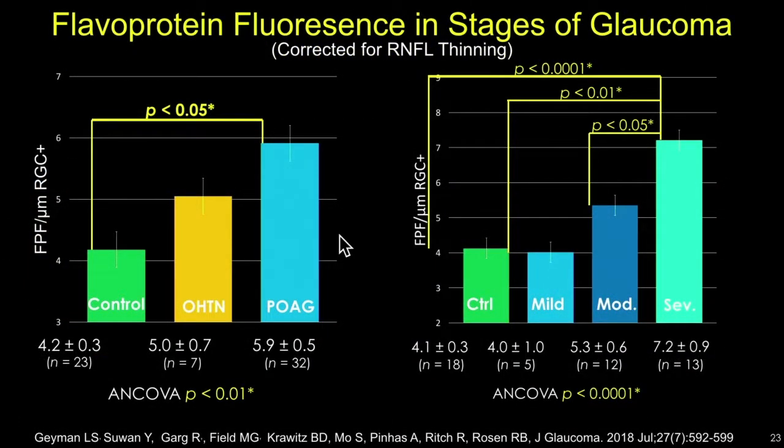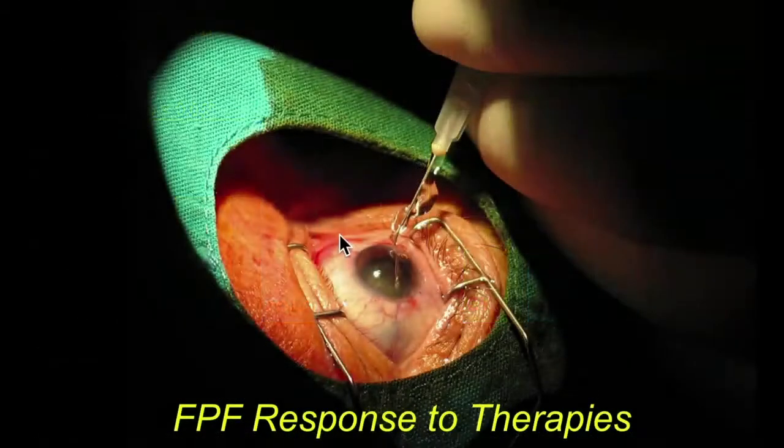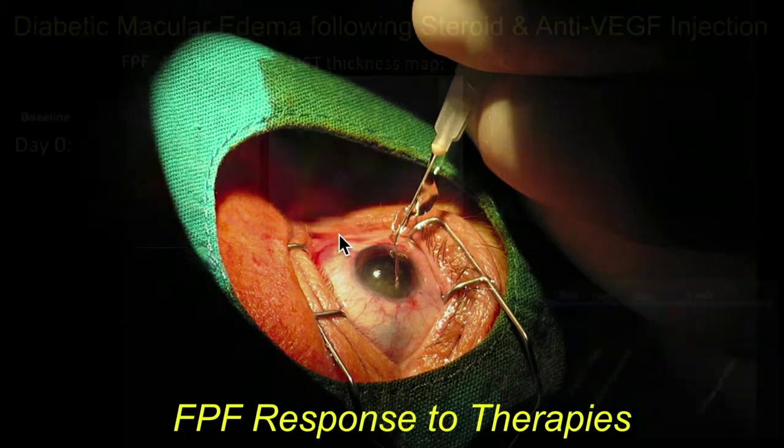Here you can see the progression in glaucoma from ocular hypertension to between mild, moderate, and severe glaucoma. What's really interesting about this technology is, unlike autofluorescence that we're all used to using in our practice, this has a response to therapy. So it will reverse. And so this gives us tremendous potential as a biomarker.